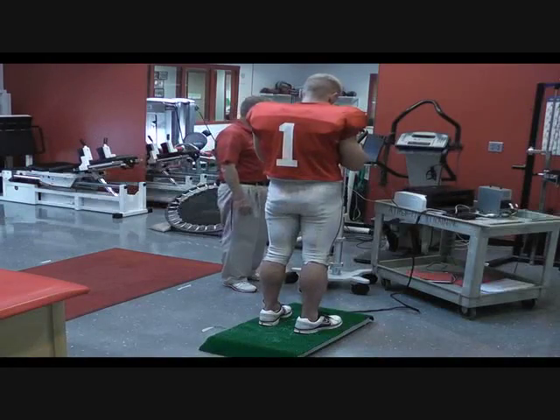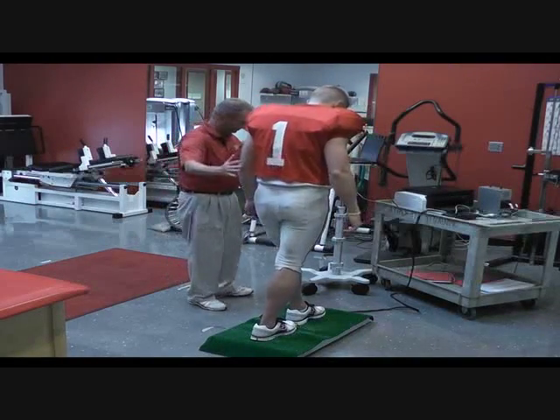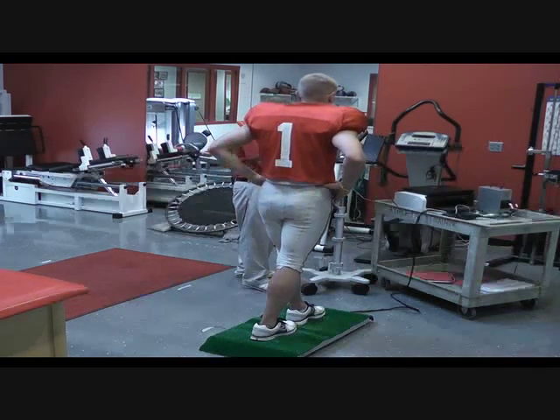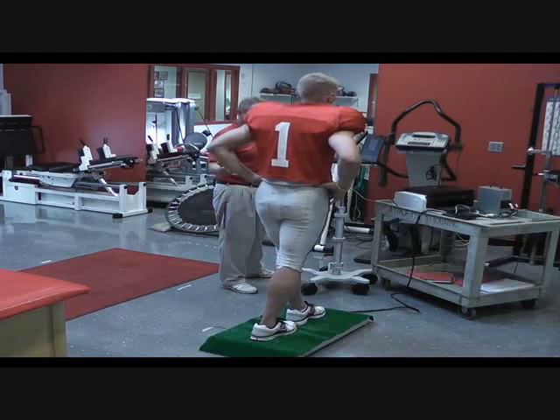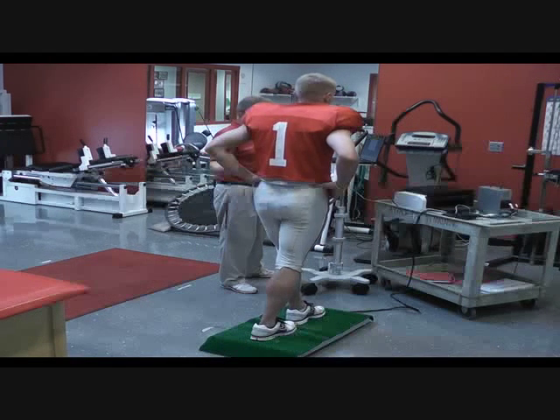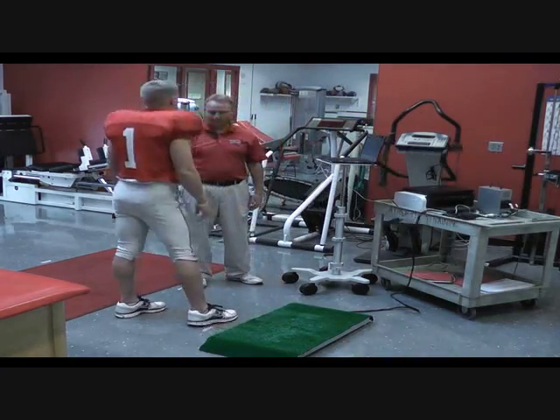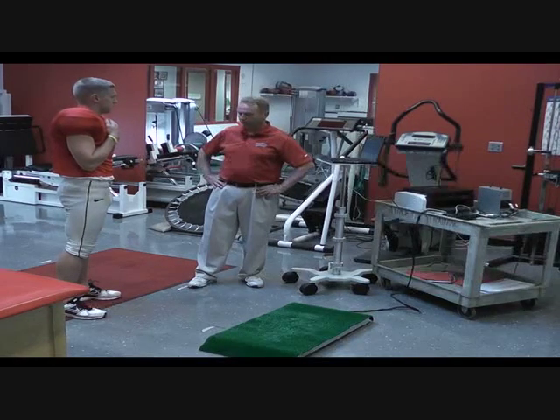For the third part of the test, we're going to have your feet heel to toe — right foot in back, left foot forward. Gaining your balance, hands on your hips. When you close your eyes, we'll count for 20 seconds. Ready, begin. The computer is measuring any sway or movement, and we'd use this as your baseline. If you have any injuries in the future, we'd compare that to see if your sway or balance is worse after a head injury. That was your baseline test. We'd be able to use that on the sideline and make a determination as to whether we're going to return you to play or not.